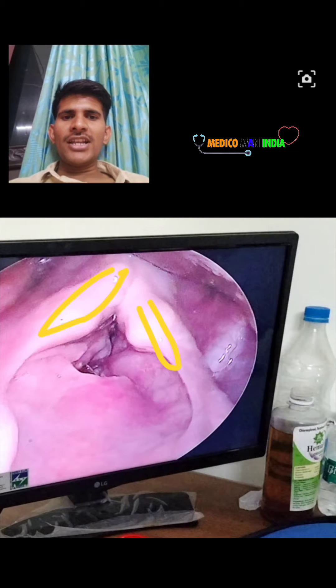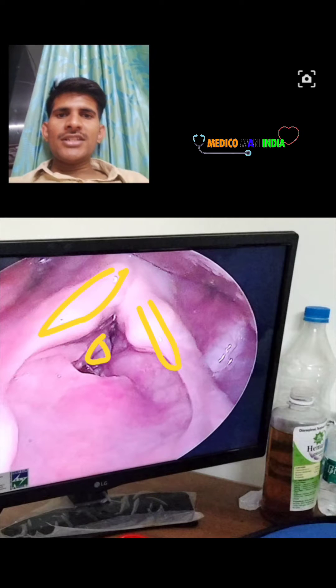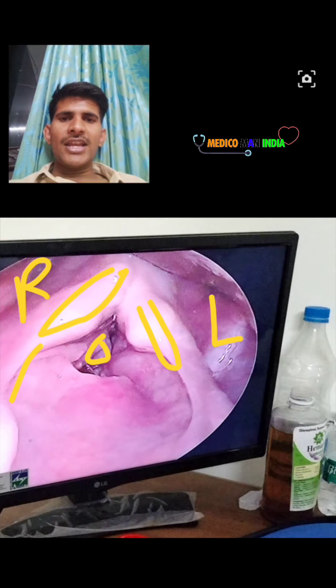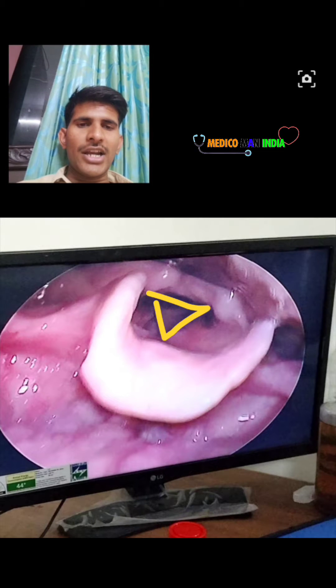These are the two arytenoid cartilages. Here is a tubercle — this is a pathological tubercle. This is the right side pyriform fossa and here is the left side pyriform fossa. This is the aryepiglottic fold. Here we have a triangular space, and inside we can see the tracheal rings.